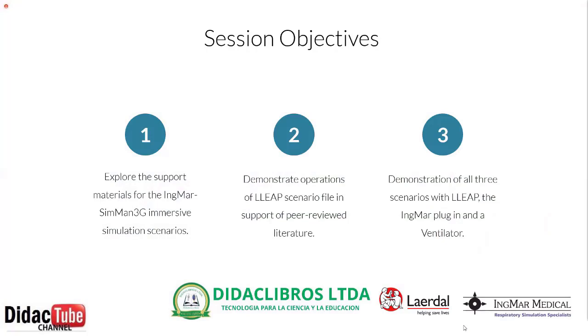So we have a few objectives here today. Our first objective is to explore the support materials for the Ingmar SimMan 3G immersive simulation scenario, which Liz already touched on. The second objective is to demonstrate operations of a LEAP scenario file in support of peer-reviewed literature. And the third objective is the demonstration of all 3 scenarios within LEAP, the Ingmar plugin and the ventilator, which you'll see here in a few moments.